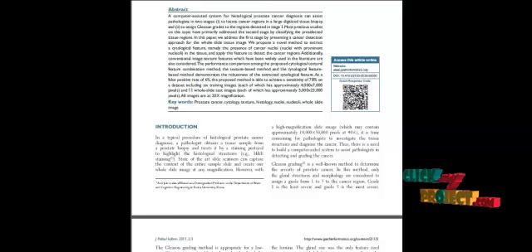The features were extracted from the segmented regions using GLCM and mean and standard deviation values. So here we are extracting the texture-based features and the mean and standard deviation features from the tissue images. We also train on the tissue images based on the features extracted.